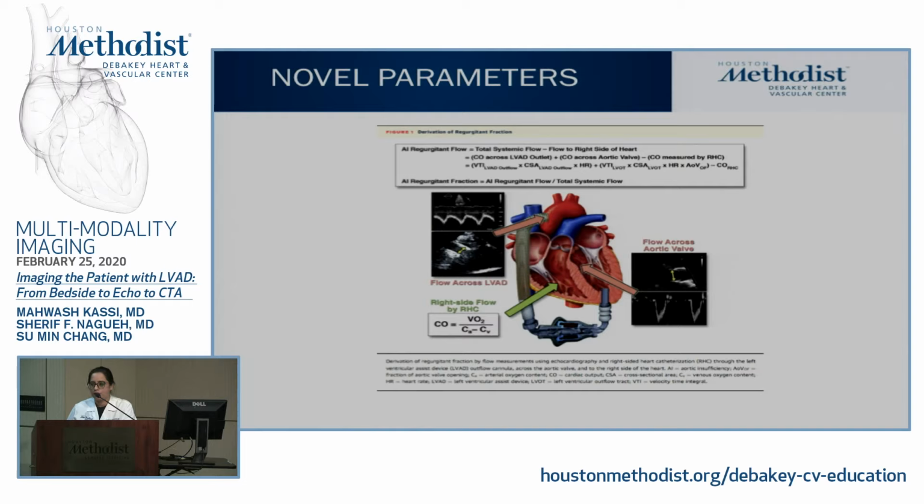It makes logical sense, but their gold standard is a little bit iffy. One could say that, cardiac output from right heart cath, how accurate is that in patients with LVAD? One. Two, a lot of times we don't get accurate LVAD outflow cannula imaging, and then using that to calculate the LVOT in itself is a pitfall to start with.